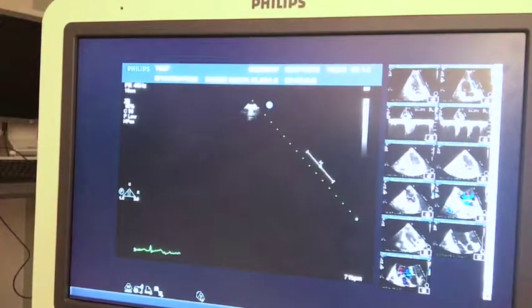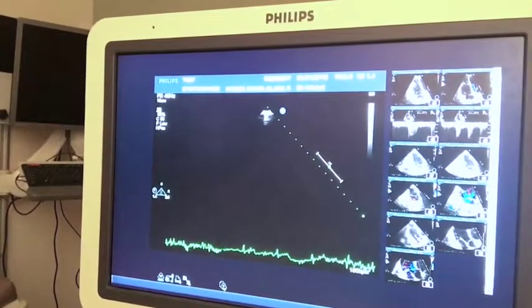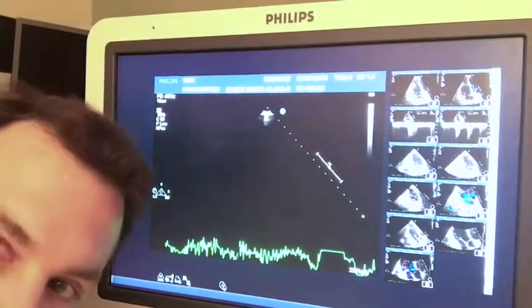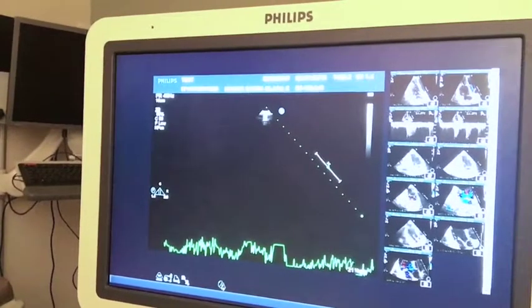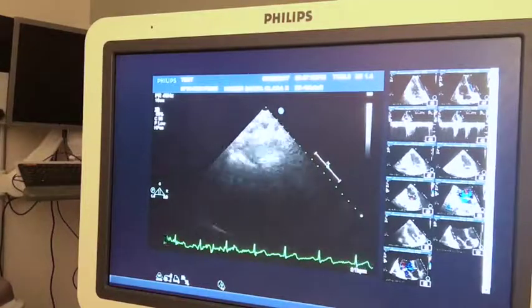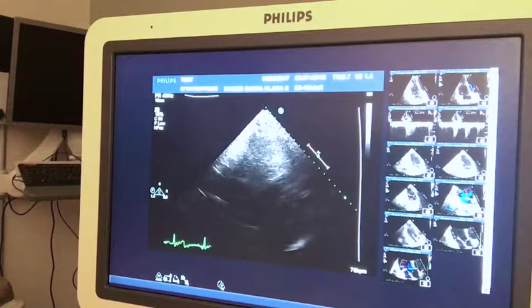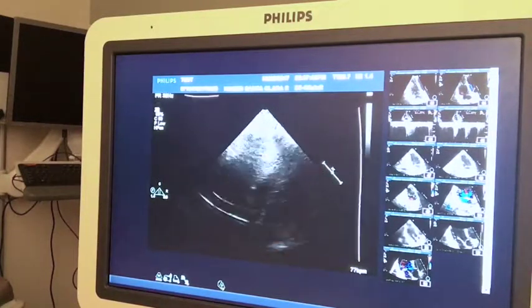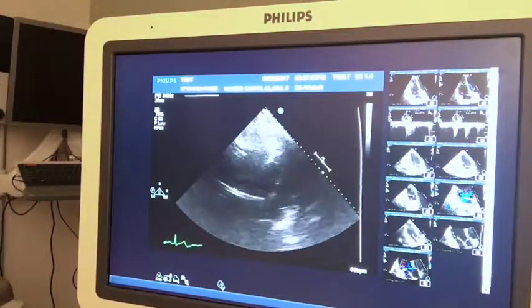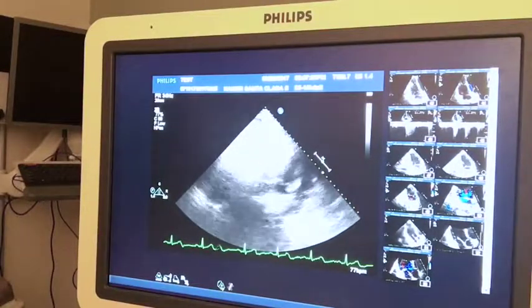Now I'm going to ask the patient to be flatter so that I can get reasonable subcostal view windows. And it depends on the patient. This patient is a good candidate, with excellent resolution, very good pictures for ultrasound, so they're appropriate. Some patients are pregnant, some are obese, some are super annoyed about getting pushed on their stomach. So you have to measure how much effort you're going to put into getting the answers.